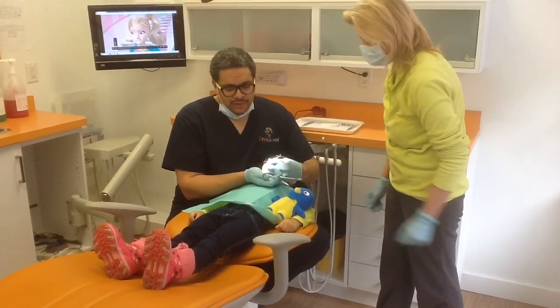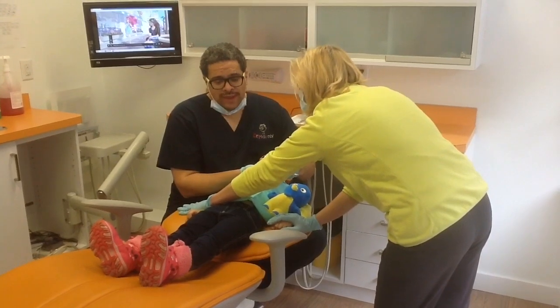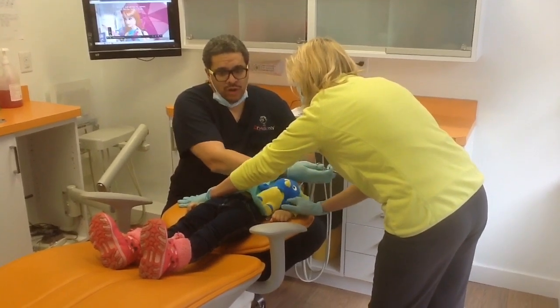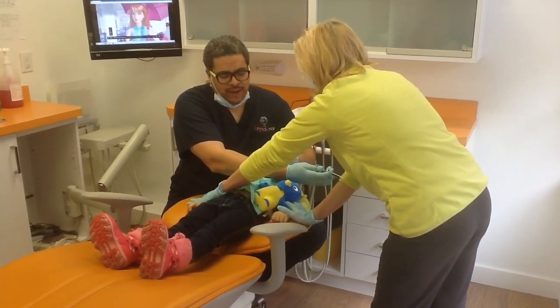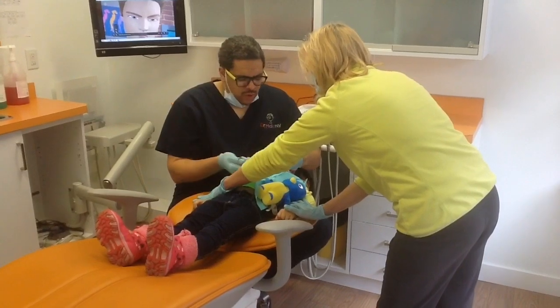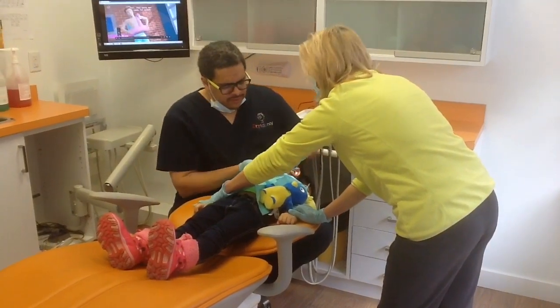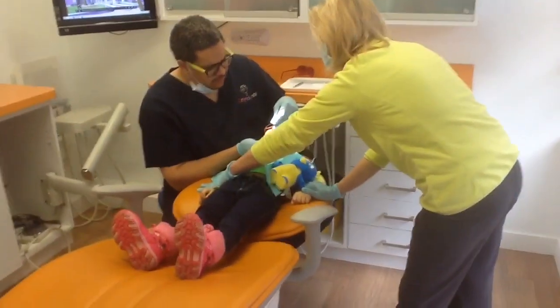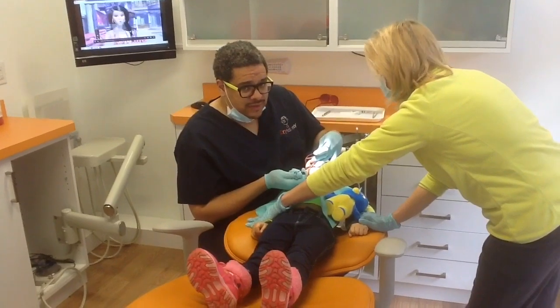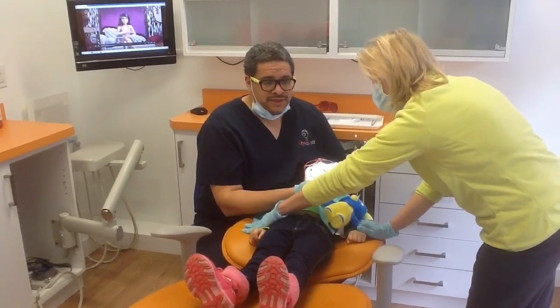Everything is underneath the chin, and Elena will guard by covering the arms — what we call passive restraint. She doesn't necessarily hold the hands, but you want to avoid any inadvertent hand movement. My hands can also act as a protective guard if the kids are uncooperative and their hands are moving up. I have control of the patient's face and can also help guard the arms. For a lower injection I come from underneath the chin, and for an upper injection I move the cheek away and come in this way. The important thing is to make sure you have access to the field and are protecting the patient's arms.